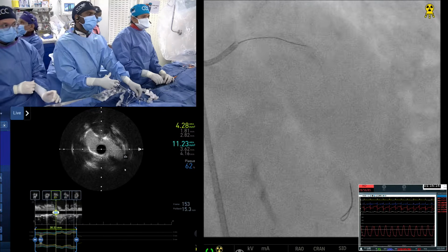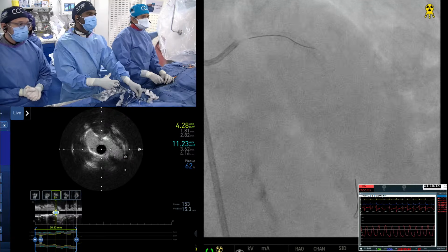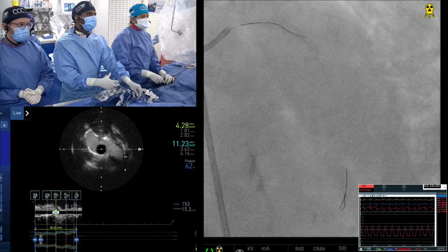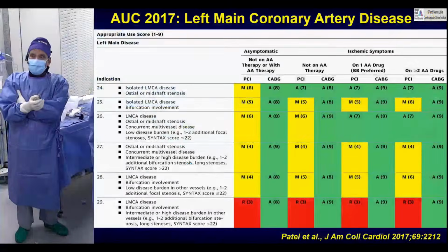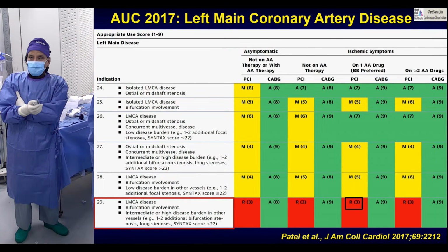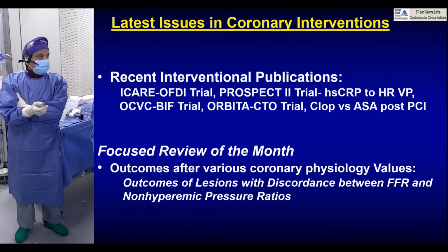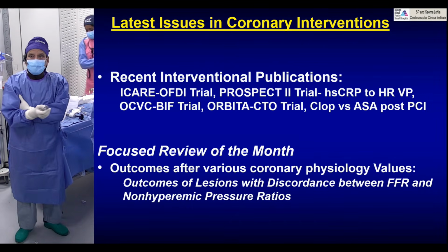But definitely get a 2B3A. All right, so I know the patient was on clopidogrel. Maybe whatever the PRU is, another issue. The patient is on 81, but there is no contraindication in giving any additional strong antiplatelet therapy. Okay, so let's go quickly while they are trying to retrieve the diagonal branch.